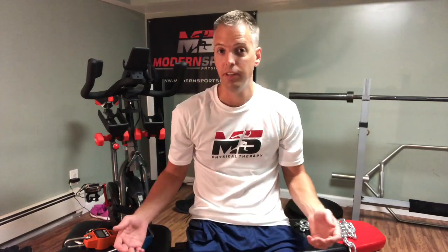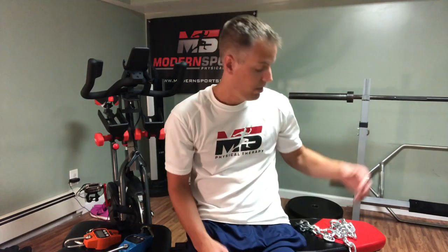Now that you've seen the numbers are pretty close, it's cheap to set up, and the materials are easy to get on Amazon or at your local hardware store — there's no excuse why you can't be testing somebody's quad strength and determining their quad index. It really is that important, especially after ACL surgery when you're talking about returning to sport. Give it a shot, try it out on your patients, and let me know how it goes.